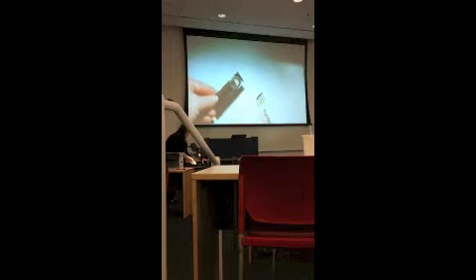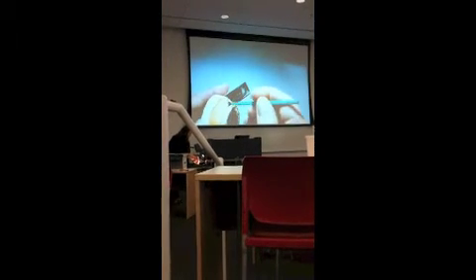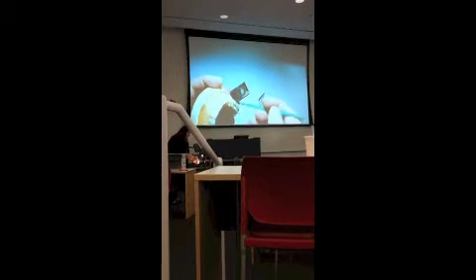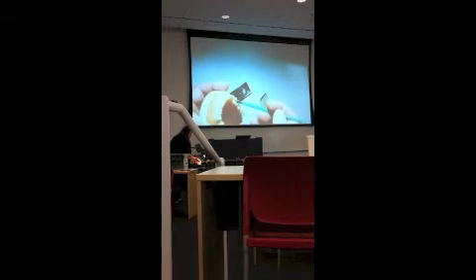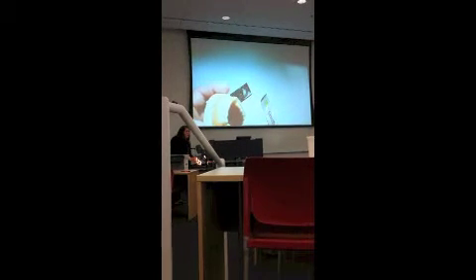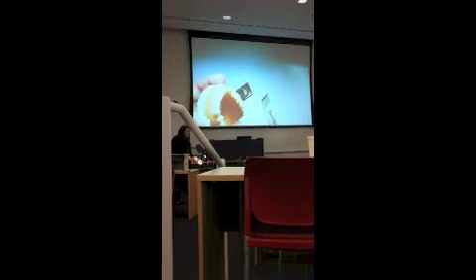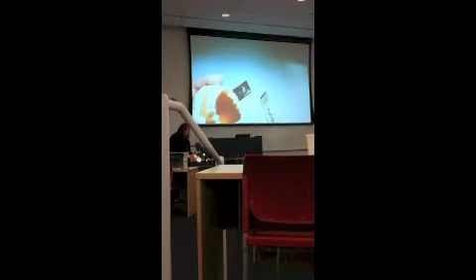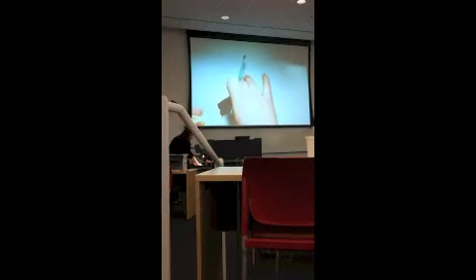And then you're just going to very quickly apply the varnish on all of the surfaces of the teeth. So all the buccals, linguals, and then occlusal surfaces. You're going to have to re-dip the brush every once in a while. You're going to have to dip it about twice for the upper arch or 3 times. Okay, so a thin coating of the varnish everywhere, okay?